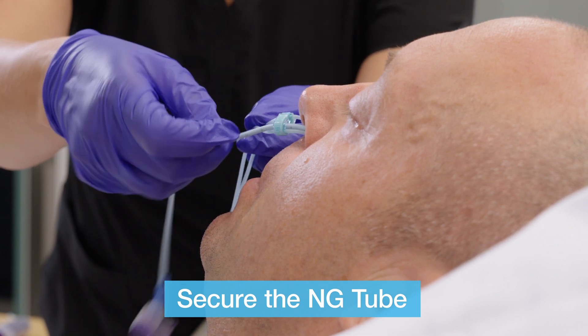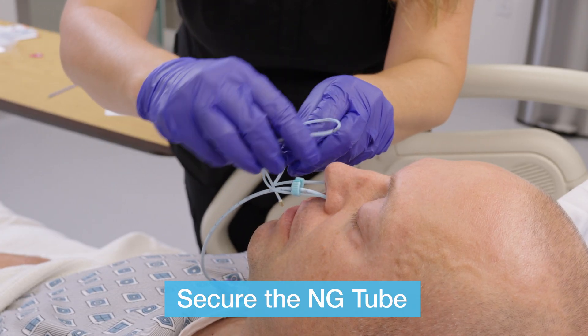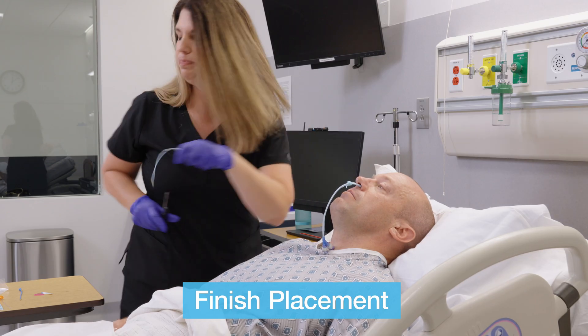Now that the nasal tube is secured, the strands of bridal tubing may be tied together in a simple knot below the clip. Placement can then be finished by cutting the excess bridal tubing one centimeter below the knot.